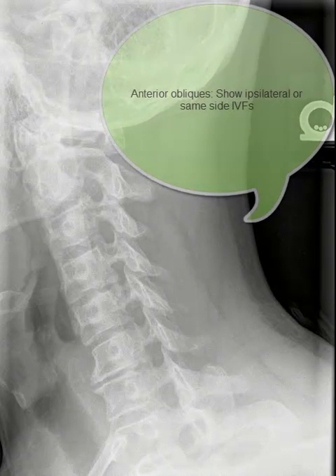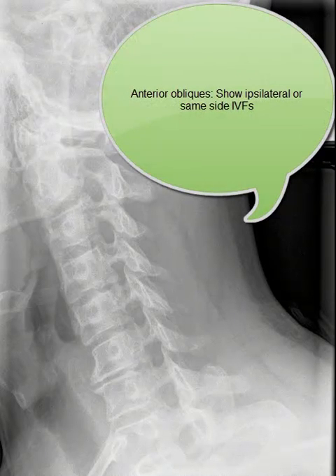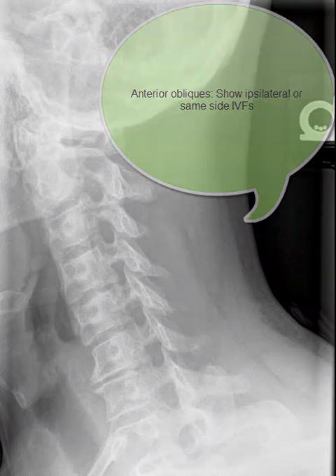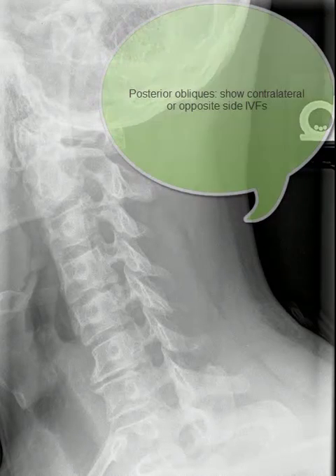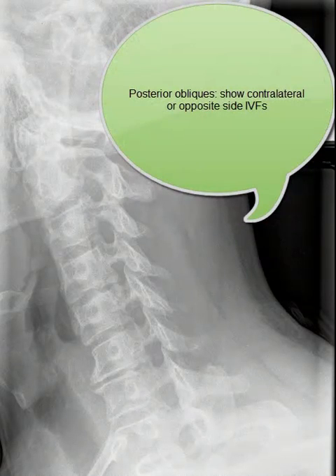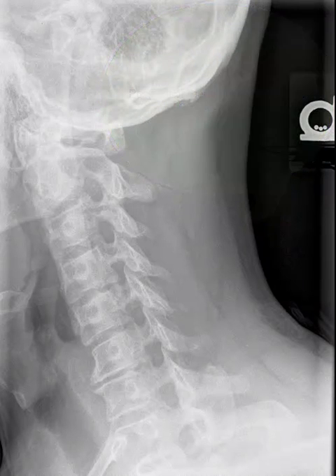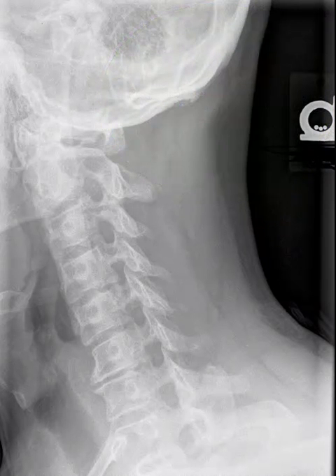In general, anterior obliques show you the same side IVFs, meaning that if you take a right anterior oblique, you'll be visualizing the right IVFs. The opposite is true for the left IVFs with anterior obliques. When taking posterior obliques of the cervical spine, you will visualize the opposite, or contralateral, intervertebral foramen. For example, if a left posterior oblique radiograph is obtained, the right IVFs will be visualized.